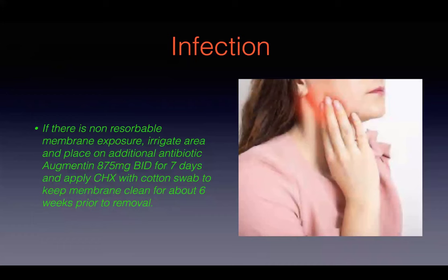Here's a 2-week post-op. That's site 30. Here's the 4-week post-op. And the 5-month post-op. You can see how much bone we gained. So just for reference, I used the same digital implant from the pre-op planning, and I dropped it here. And you can see the difference, how much more bone that you can add. A wider diameter implant that you can now place. And these were a 3.7 and a 3.2, 3.2 on the left, 3.7 diameter implant on the right.